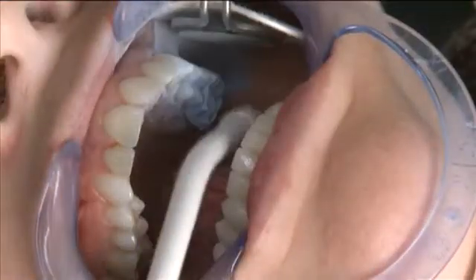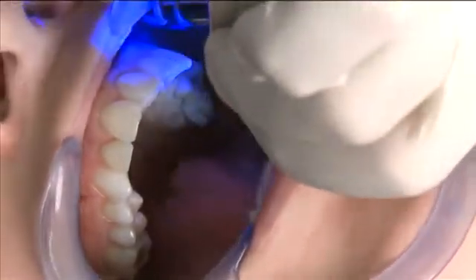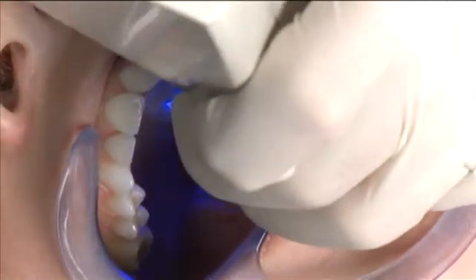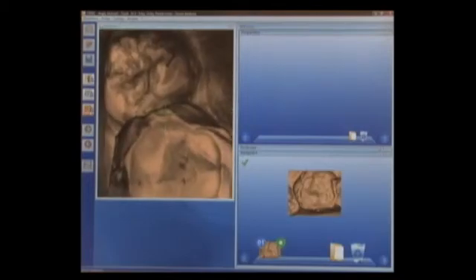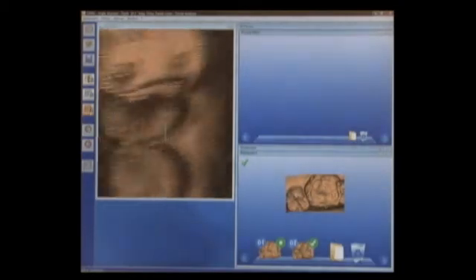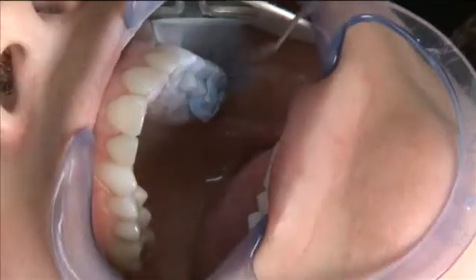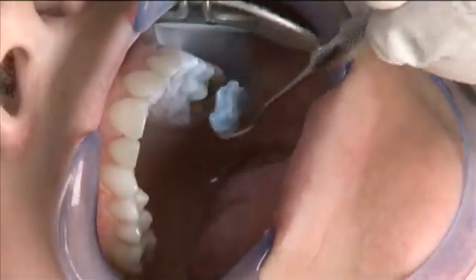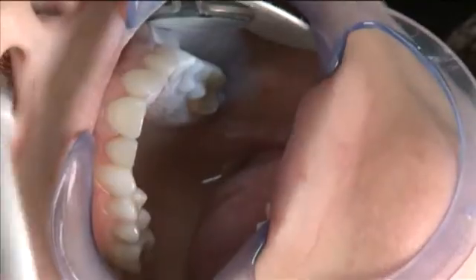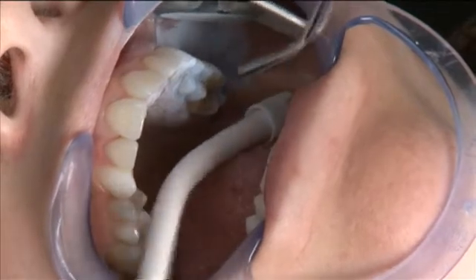Now we're going to begin capturing images for the bite registration in live capture mode. I'll insert the camera, centering first on the bite registration itself, capture that, then go to the tooth distal to it, and then also the two teeth to the mesial. Now we can simply pop the bite registration off and powder the prep a little bit. I'm going to dry the prep just a bit and then touch up the prep with a little OptiSpray.